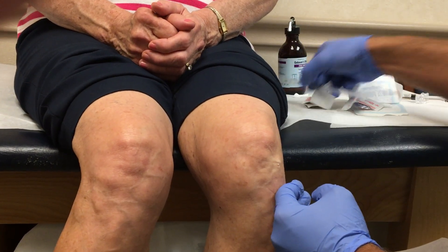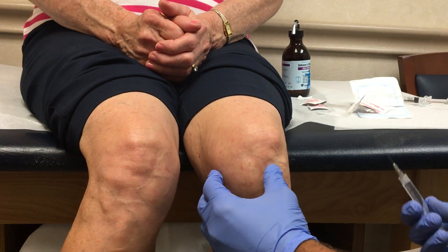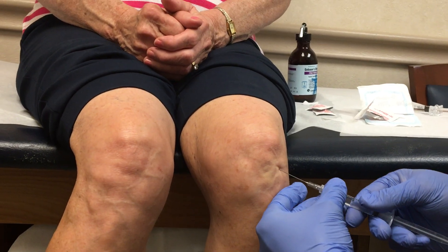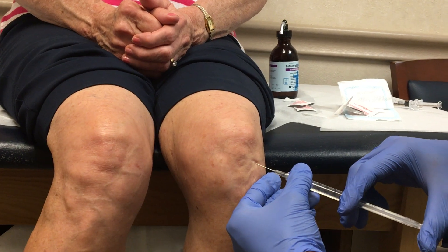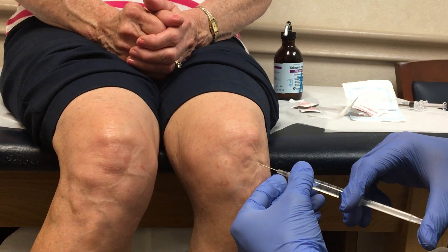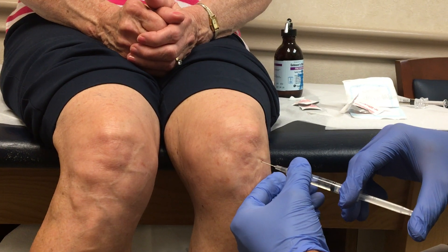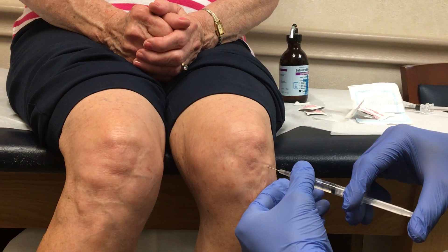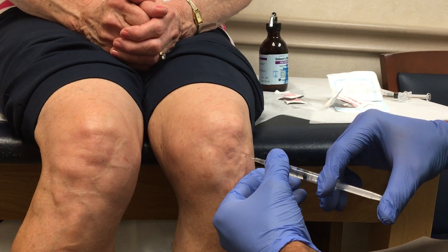So then I'll take the needle — I use a 22 gauge needle — and I start with three cc's of lidocaine. And as I inject, I give a little quick shot there, and then I inject slowly as I'm going into the joint line, aiming towards the lateral femoral notch. You can see me injecting really slow, advancing slowly, and I'm advancing with the bevel down. I'm injecting lidocaine at the same time, and I'm looking for loss of resistance.